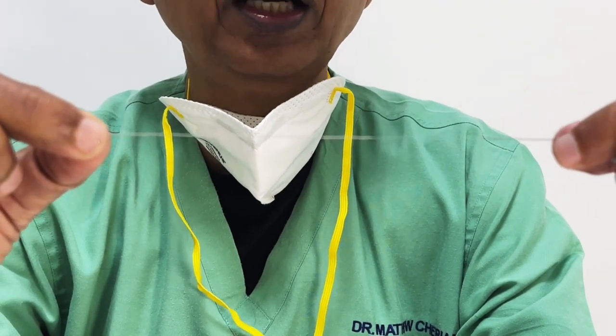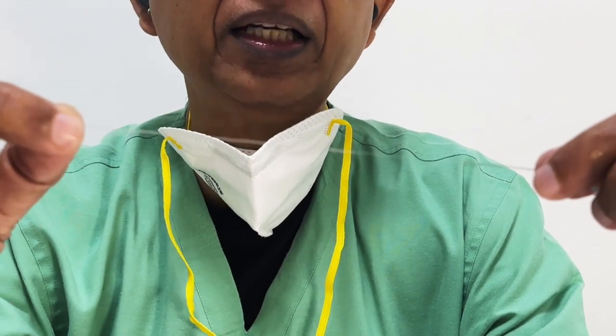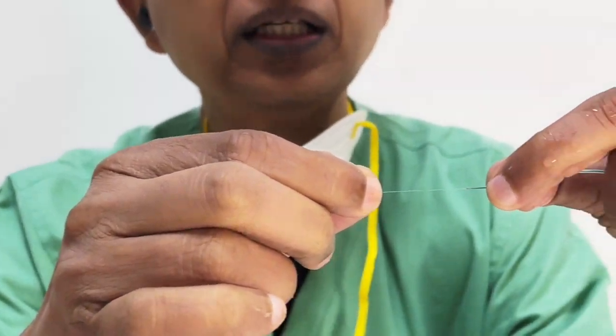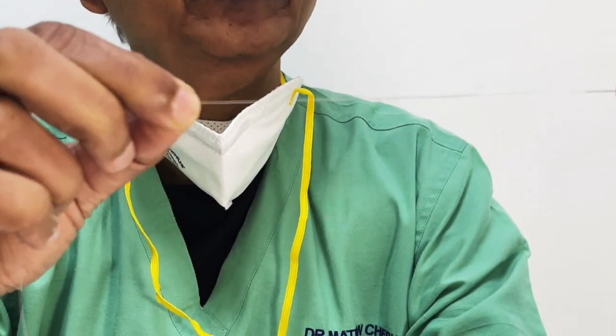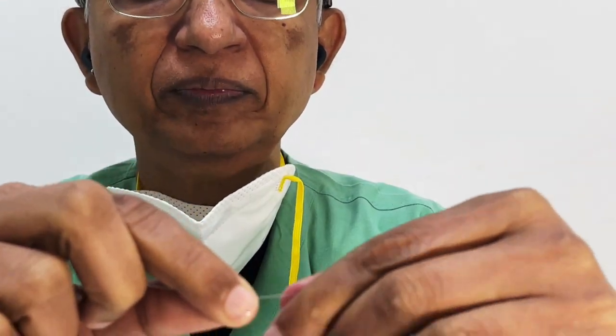Very simple. How can you make a coil stretch resistant? If you put a silk or a nylon thread in the inner core, it makes it stretch resistant. So this is what has happened here. This part cannot stretch because, though you can't see, they've got a fine nylon braid that is running in the center. I hope you understand it. Some people have even used nitinol braiding. So what happens is it may stretch here, but it will not break. Initially, when coils came, this was a big problem. They would stretch and you could not pull the coil out. But remember here, don't get worried.